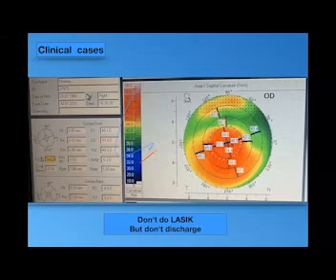So we are not sure about the autorefractometer astigmatism, which may be related to other parts. Yes, I mean this. Okay, but this cornea could be with other problem than the conus.